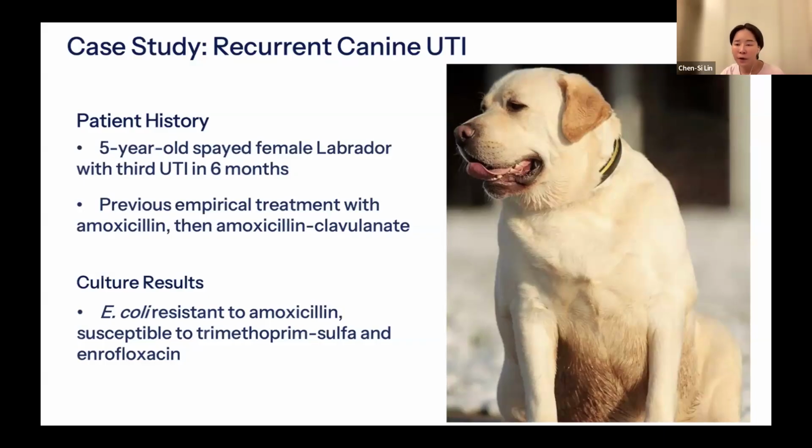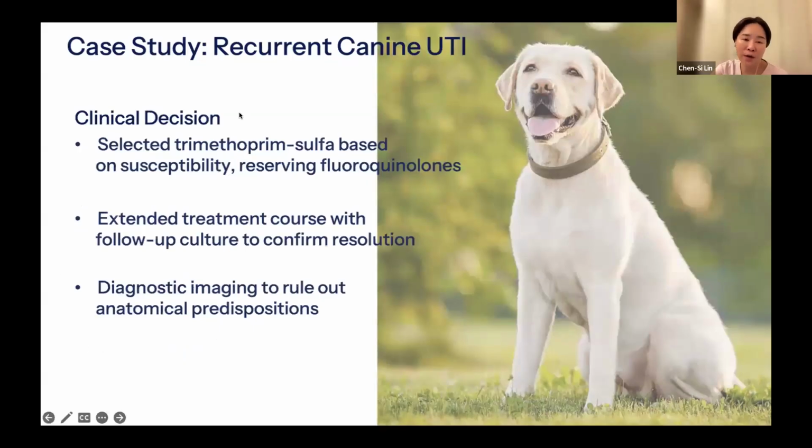I think it's a very simple case that we've already seen many times. Finally, they made clinical decisions based on the antibiotic test results. They chose the proper antibiotics, extended the treatment course, and did a follow-up culture. So again, they did another round of culture. Finally, the case was okay and discharged. It's a very simple case, but it showed us the standard protocol that we need to consider for the antibiotic AST test. So before the treatment and during the treatment, it's very important.